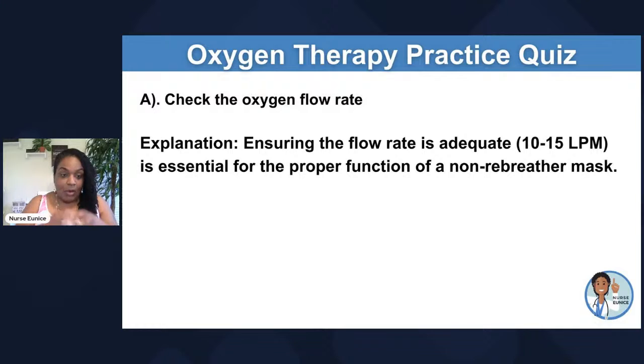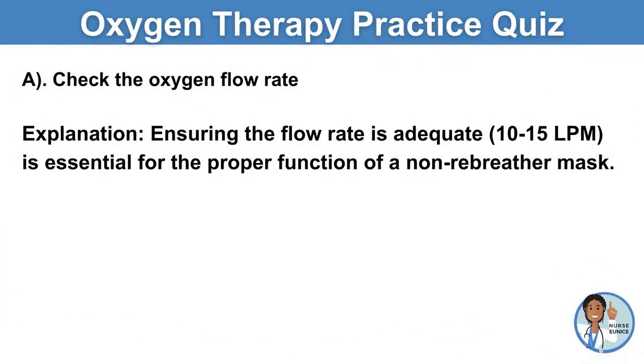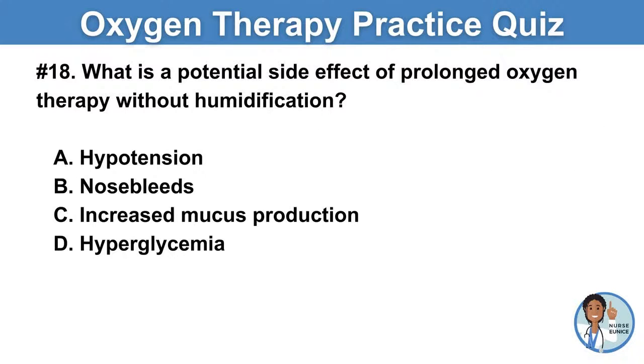So if it has a reservoir bag, you need to make sure that your valve or that your flow rate is 10 to 15 liters per minute. Whatever the max is, just max it out.